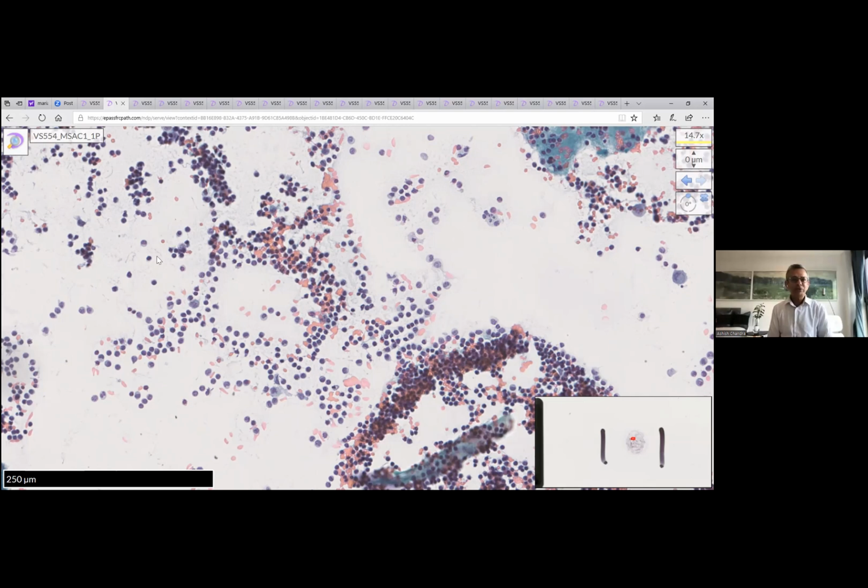Low-grade lymphoma. I was waiting for that question to come up. I think it can be in the differential. However, it's important that we rely on our cytomorphology. So with the low-grade lymphoma, you'd expect to see more of a monotonous lymphoid population, but you also need to be guided by the clinical history and also imaging. So does the patient have widespread lymphadenopathy? Is low-grade lymphoma in the clinical differential? So as a reflex, I wouldn't send all my lymphocyte-rich effusions for flow cytometry, because one, it's not necessary, and two, we just bombard flow cytometry with lots of these samples. But I think you need to be guided by the clinical.